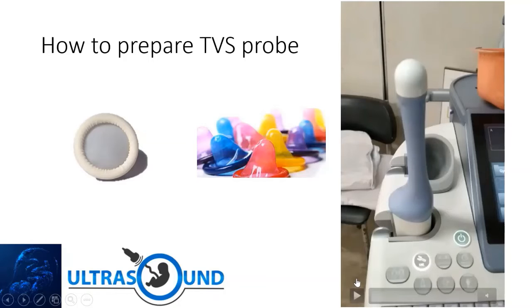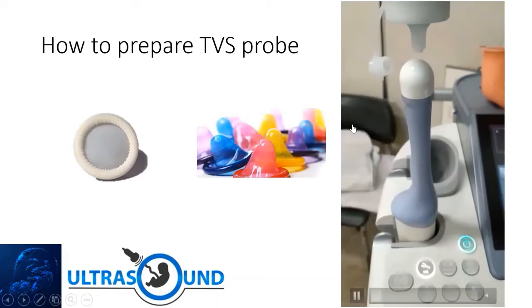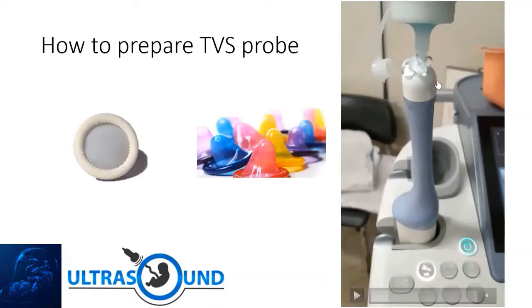So this is how I will prepare my TVS probe. Okay, some people may pour this gel into the tip of the condom, and then only put the condom on top of the probe. But this is how I will do it.